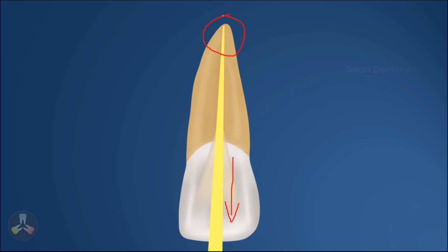That says that there is a close adaptation between the master cone and the root apex. If there is a tug back, then your treatment will be successful. A little beyond, little short may not create a problem, but not getting this tug back will usually create a problem and a clinical failure.